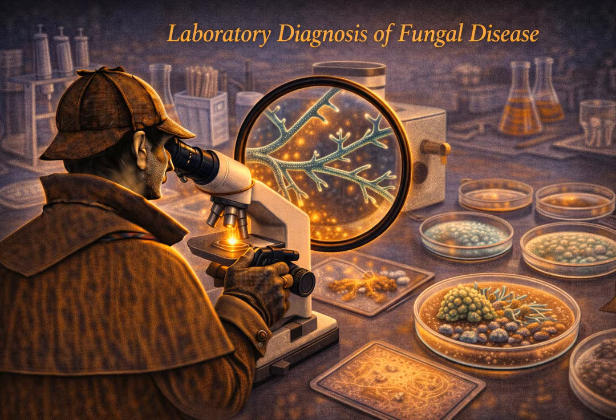Right. And the fruiting head, the part that actually makes the spores, is iconic. It looks exactly like a dandelion that's gone to seed. You have a straight stalk, the conidiophore, ending in a swollen bulb called the vesicle, with chains of tiny spores radiating out in all directions. If you see a dandelion under the microscope, it's Aspergillus.